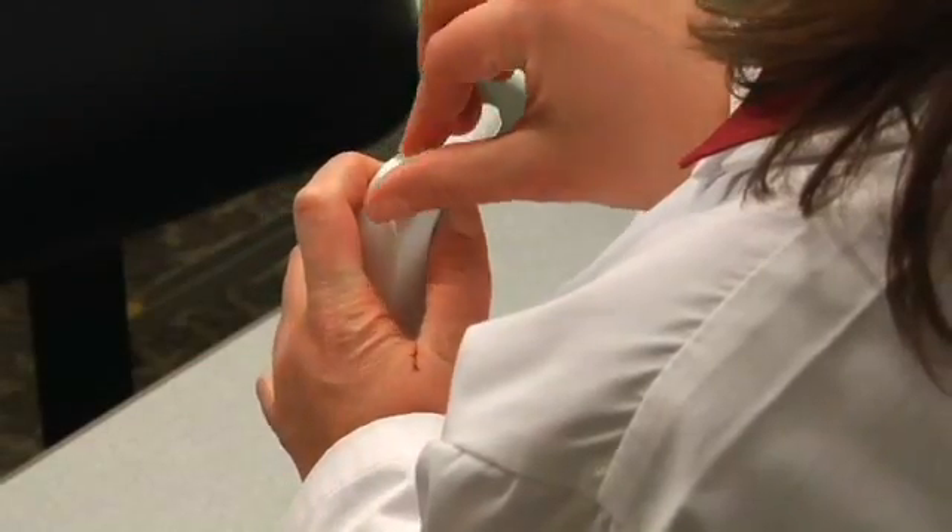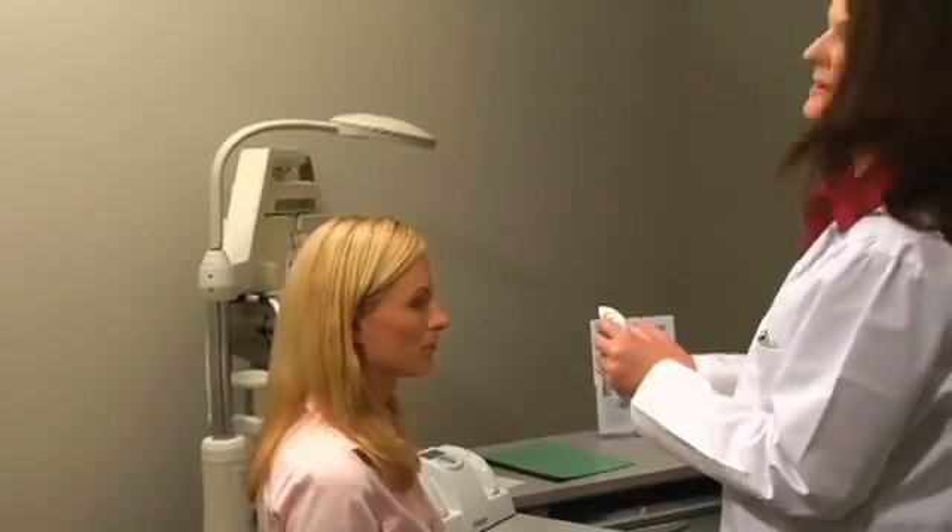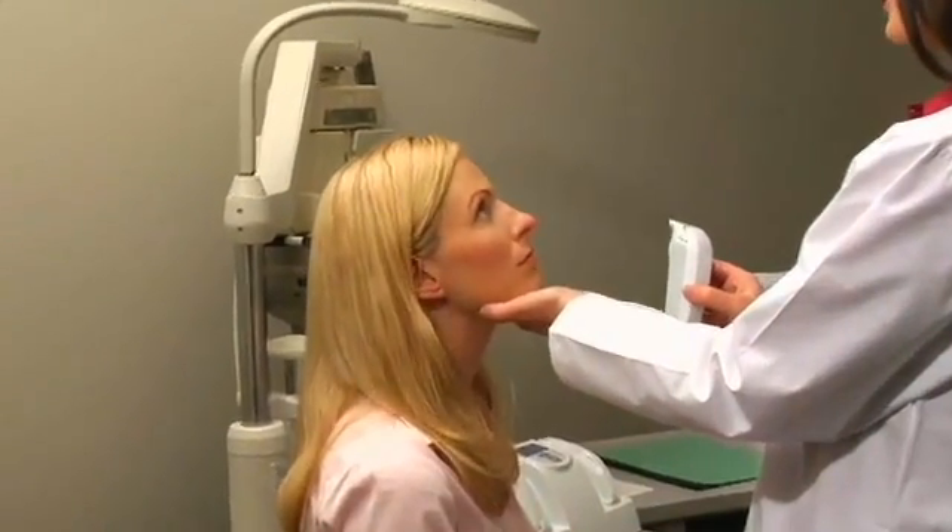Securing the wings of the test card, pull up on the protective cover to remove. Approach the patient from the side. Position the patient with their chin tilted upward and their eyes directed toward the ceiling. Remind the patient to blink normally.